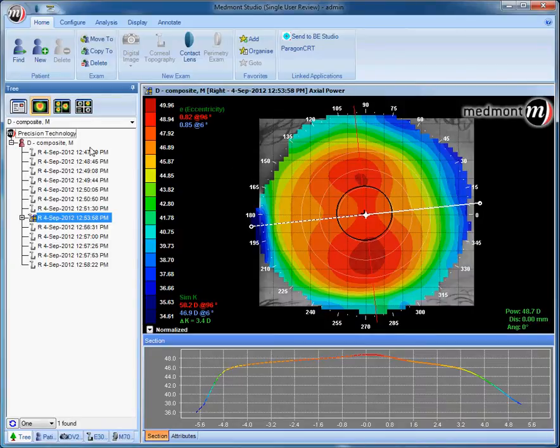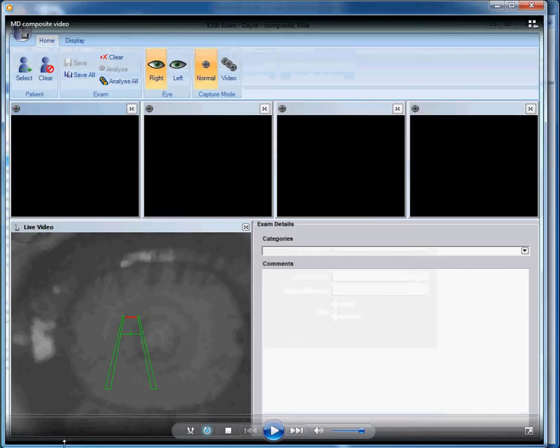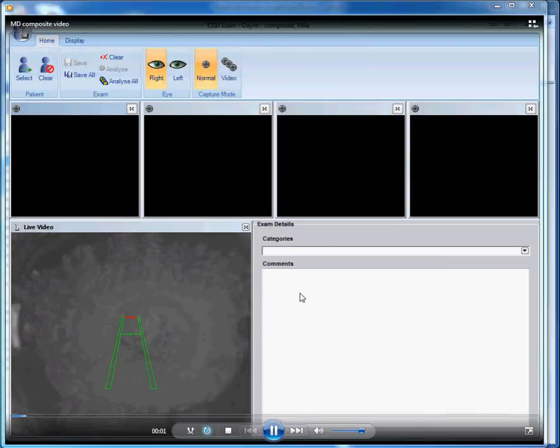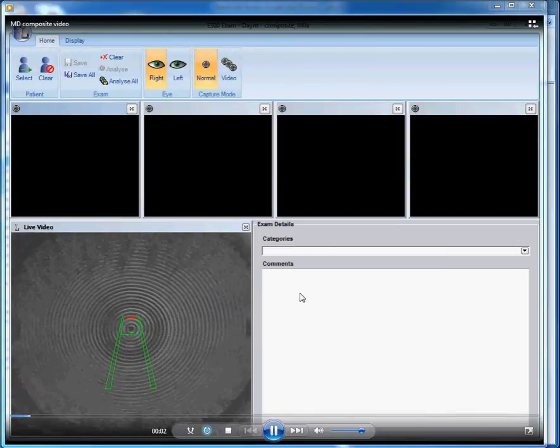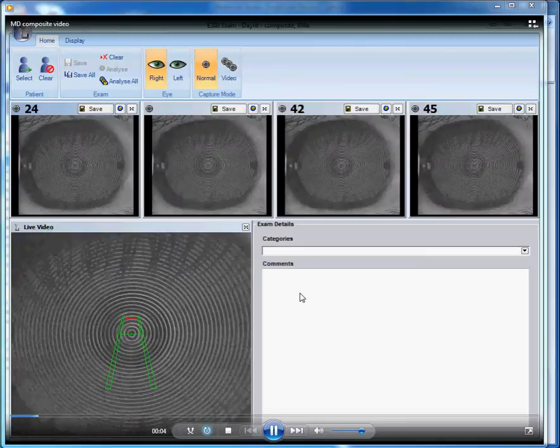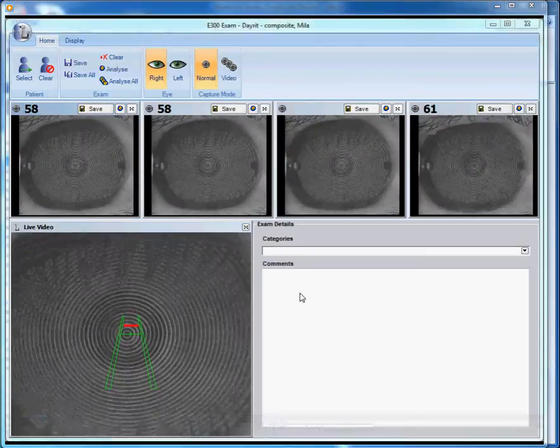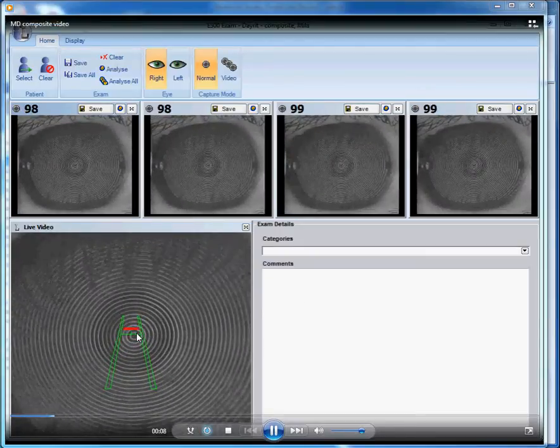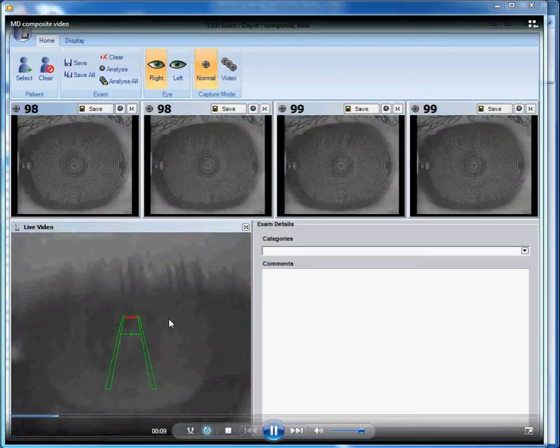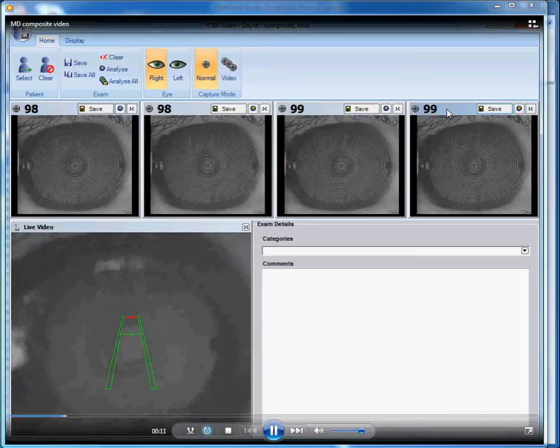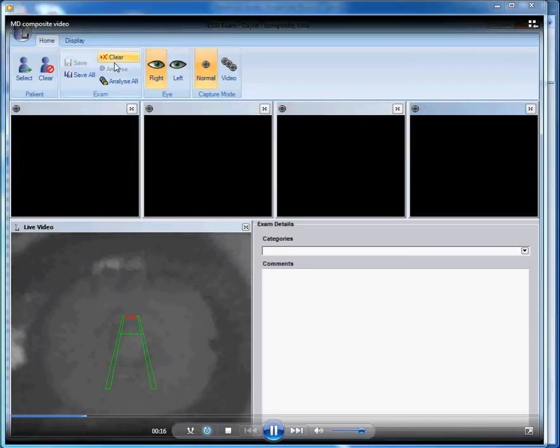Start by clicking on the patient name, then click on Capture Corneal Topography. The next step is to take a normal fixation capture. In other words, have the patient look down the axis of the instrument, centering their fixation on the central placido ring. Once you have a 95% or better capture, click Save, and then Clear Images.